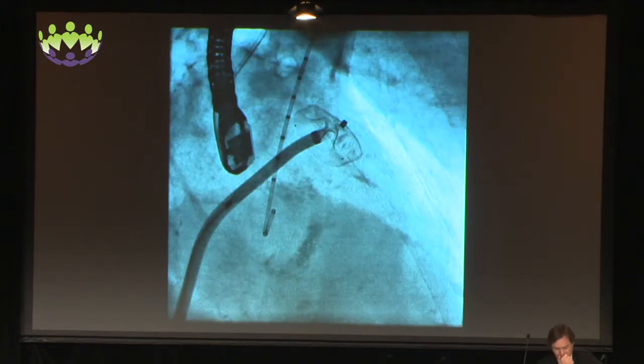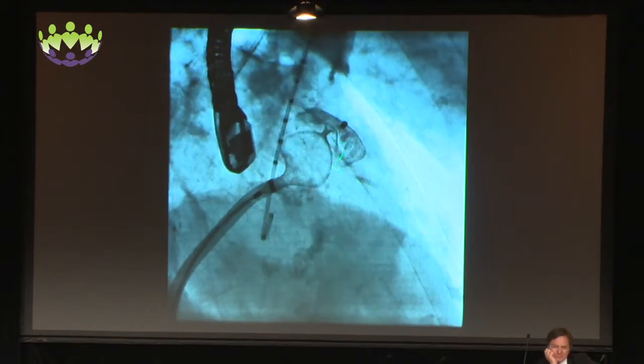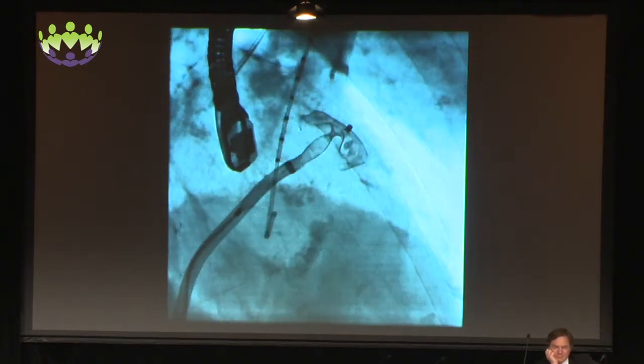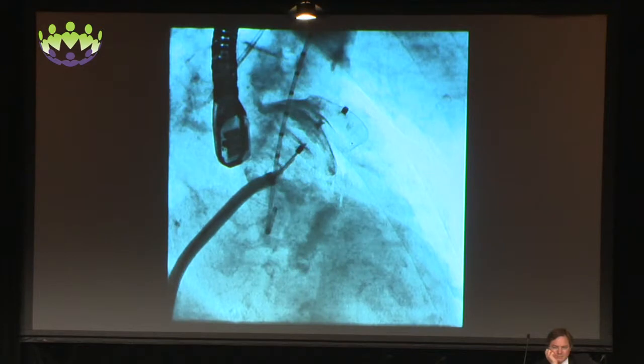So the test is going to be as I bring the disc out, and this is my tug test, if you like, I extract it, so I want to watch the waste come out from inside. There it is. And now I know that I'm coming back. I know I will never get to the PV ridge. So I'm going to assess where it is that I'm sitting. I'm still happily sitting on that ridge there.